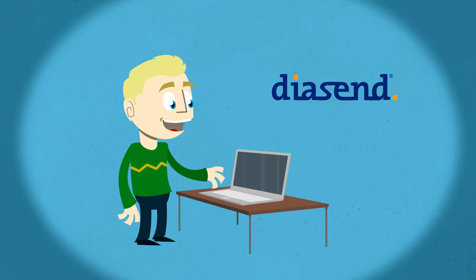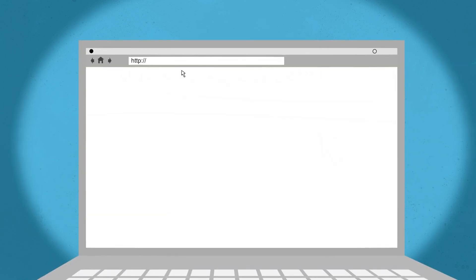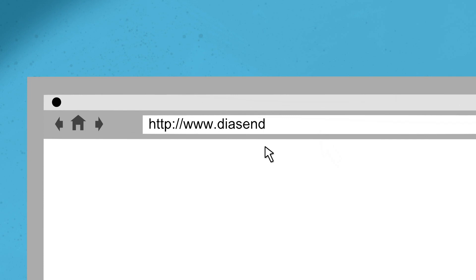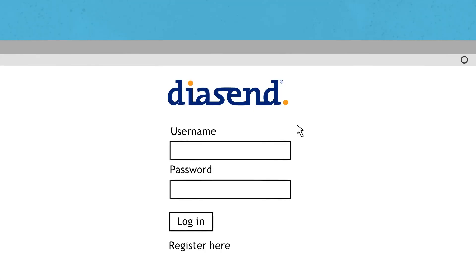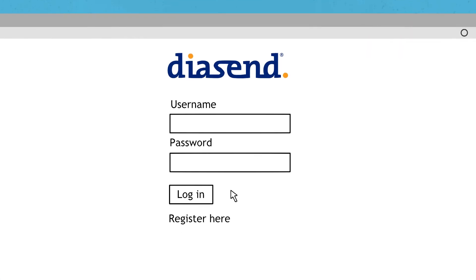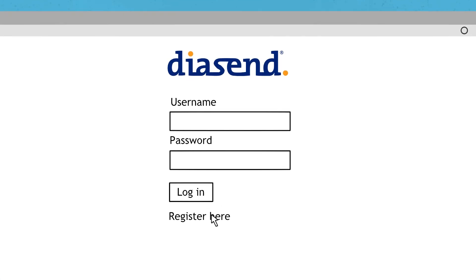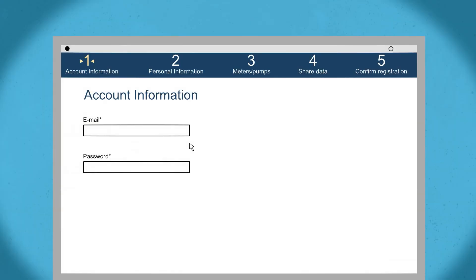First, you have to register an account at diasend. Go to www.diasend.com to register. Here, you will need to create a username and password and enter your personal information.